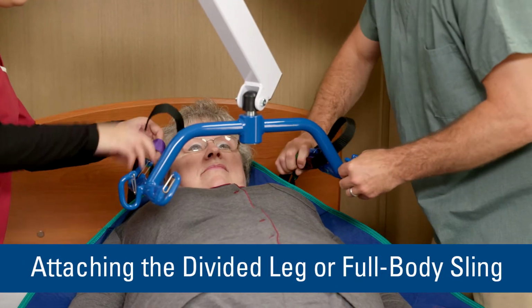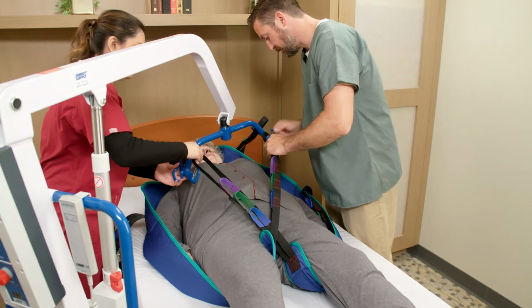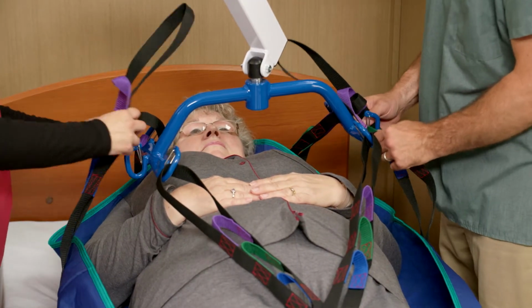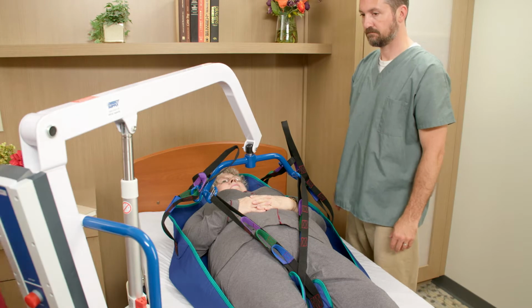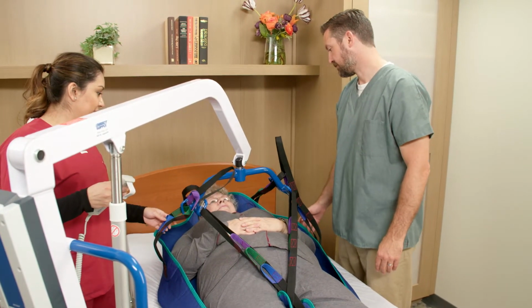Place the straps of the sling over hooks of the swivel bar or cradle, and be sure to match the corresponding strap and/or strap colors on each side of the sling for an even lift of the resident. For questions about the appropriate straps to use for each resident, refer to a supervisor for guidance before lifting a resident, and always follow your community's requirements for safe lifting procedures.